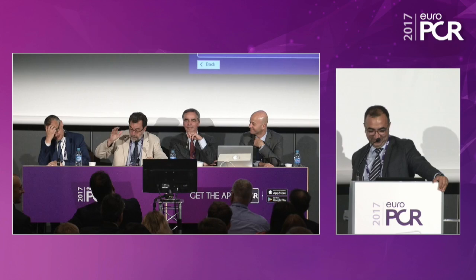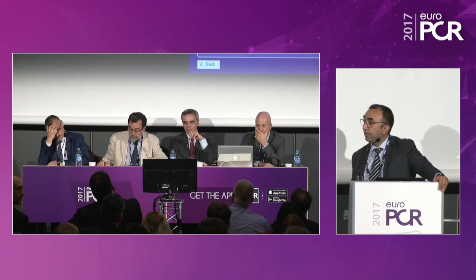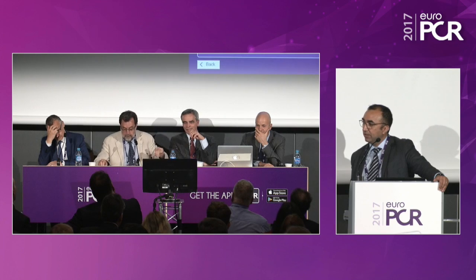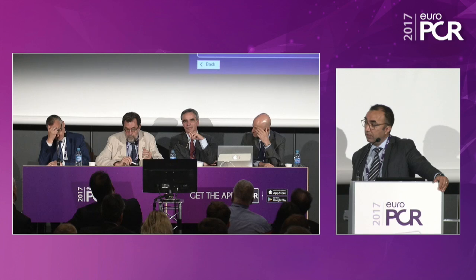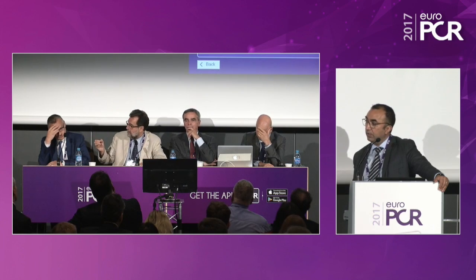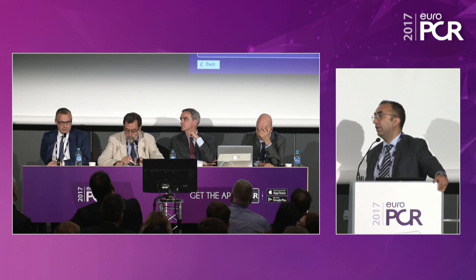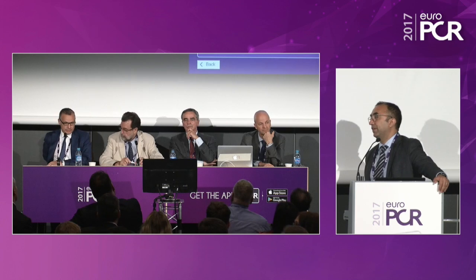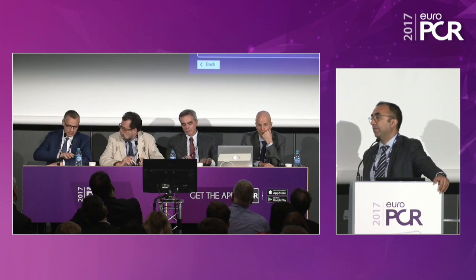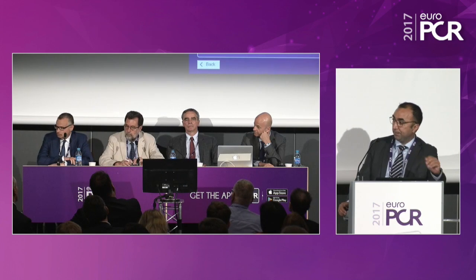So now, I would like to ask you, Francesco, you are the father, and also Karl-Heinz and Georg have a very large experience of the device. So, in your opinion, who is the best candidate for this procedure? So in my opinion, the best candidate is obviously a patient who has annular dilatation as a main component of mitral regurgitation.